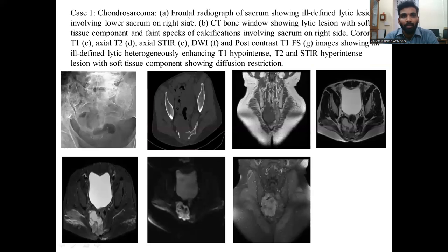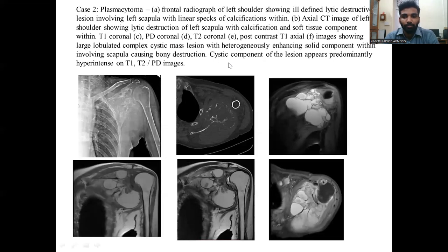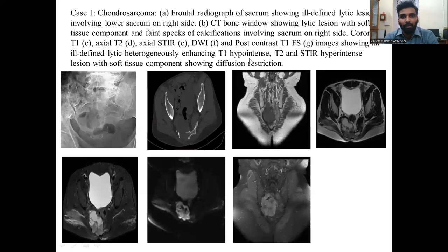Case 1 – Chondrosarcoma. Frontal radiograph of the sacrum shows an ill-defined lytic lesion involving the lower sacrum on the right side. CT bone window shows a lytic lesion with soft tissue component and faint specks of calcification involving the sacrum on the right side. Coronal T1, axial T2, axial STIR, and diffusion-weighted and post-contrast T1 fat-sat images show an ill-defined lytic heterogeneously enhancing T1 hypointense, T2 and STIR hyperintense lesion with soft tissue components showing diffusion restriction.